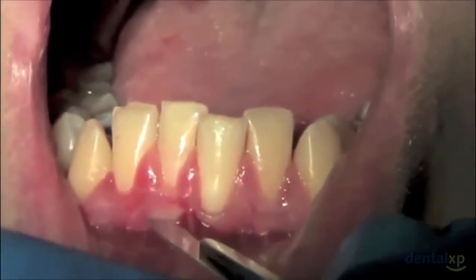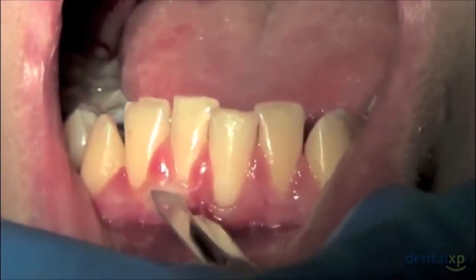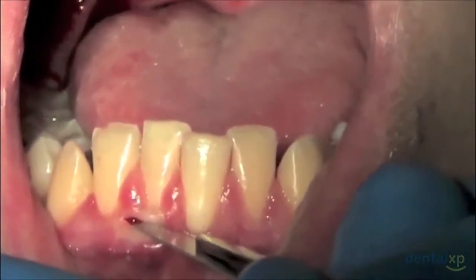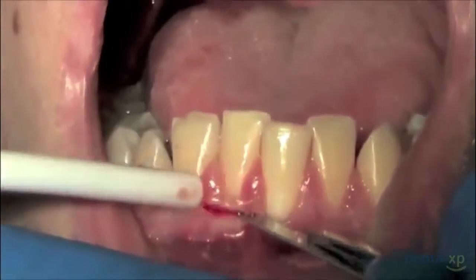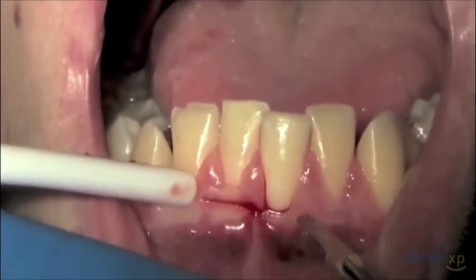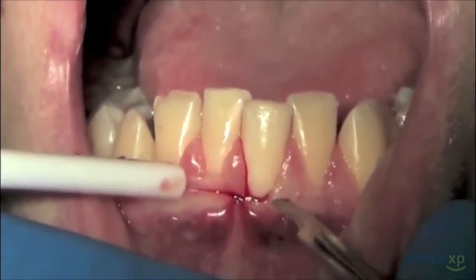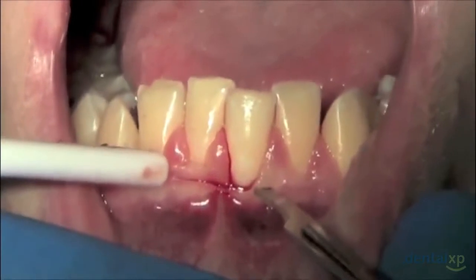At this point, it's time to prepare the recipient bed. Using a brand new number 15 blade, I'll typically make a horizontal incision across the mucogingival line. Obviously, when we get around to tooth number 24, the mucogingival line goes straight through the gingival margin, so that's where the incision will go as well.